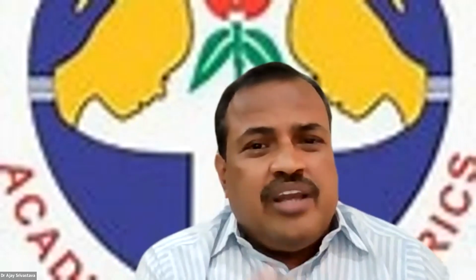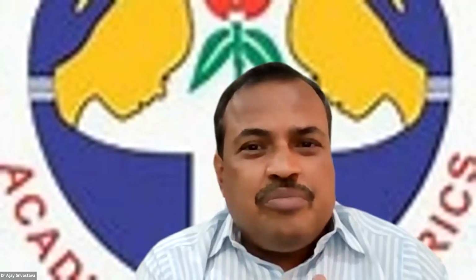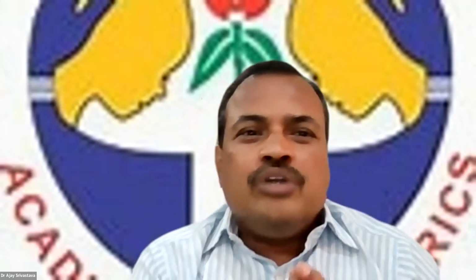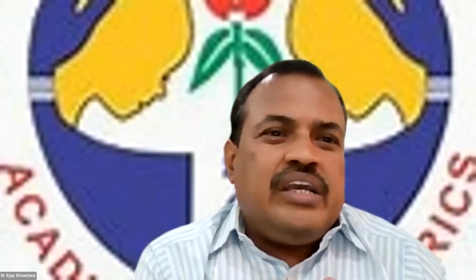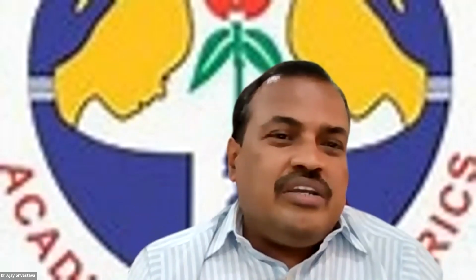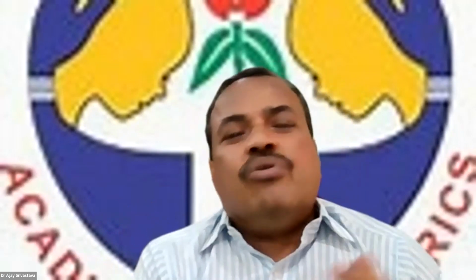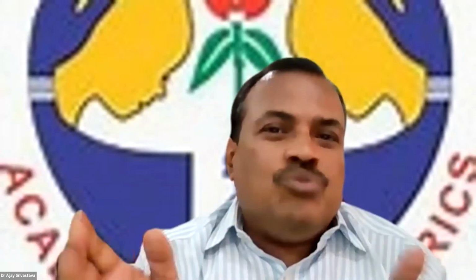तो यूजुअली जब भी लास्ट सीजर है, उसके 3 to 4 डेज इंटरवल के बीच में, ये दोनों कॉन्ट्राडिक्टरी बातें हैं. फर्स्ट थिंग ये कहते हैं कि एक बार सीजर हुआ तो उसके बाद पोस्ट इक्टल स्लोइंग हो गई, तो वो 3-4 दिन तक रहती है. ये प्रिफरेबली हम लोगों को 3-4 दिन बाद कराना चाहिए, और 4 वीक्स के पहले, 4 डेज के बाद, ये टाइम होना चाहिए. मैक्सिमम 4 वीक्स, minimum 4 days.